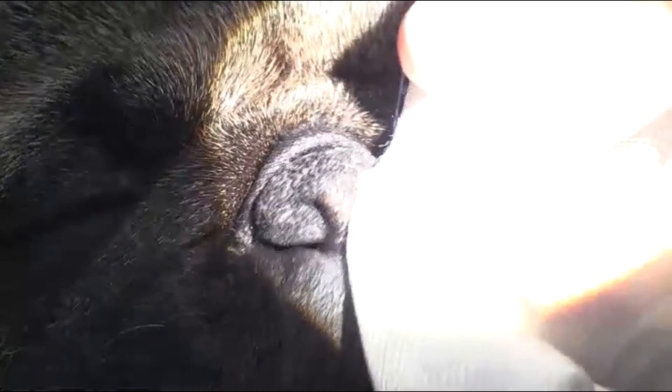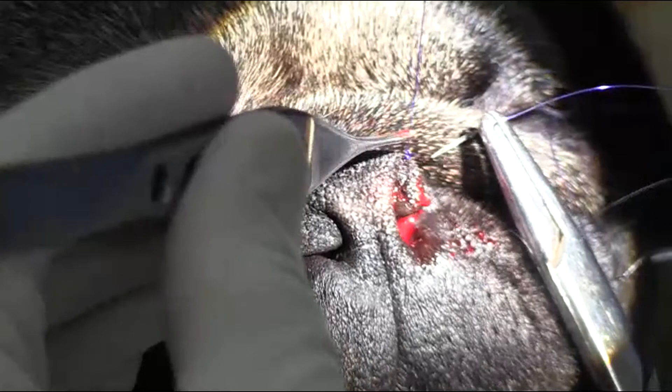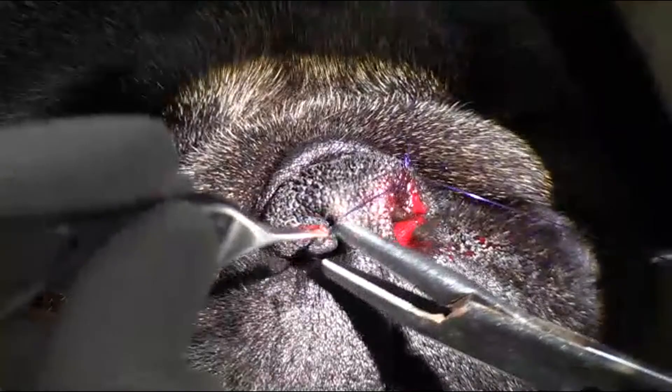We'll just do a simple continuous suture pattern. The nice thing about the stay suture is that it allows me to get quite deep into the nasal cavity, which is number one going to allow me to pull it over farther, and number two it's going to help me with hemostasis after the procedure.